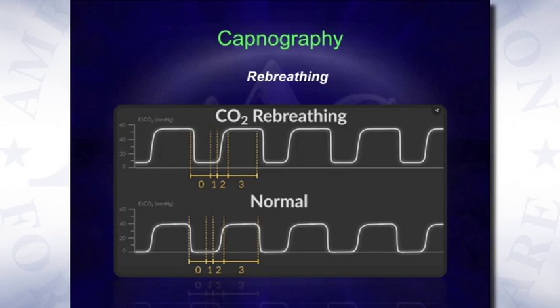What you should be able to note is that during inspiration, that is when the patient is inhaling past the CO2 monitor, the concentration of CO2 may be elevated. In a normal circumstance, we do not want to have that patient breathing in CO2 as it's going to impede proper ventilation and indicates a problem that needs to be corrected.